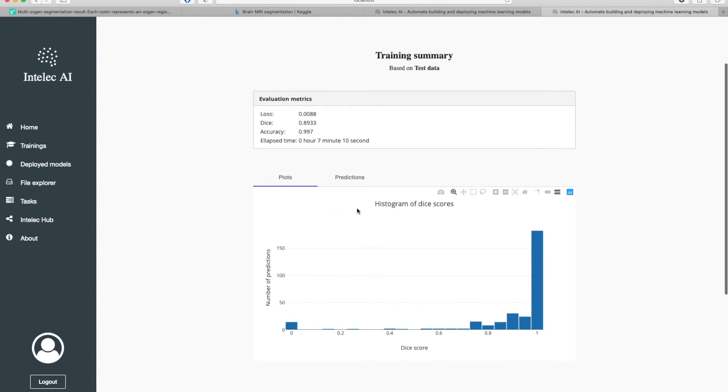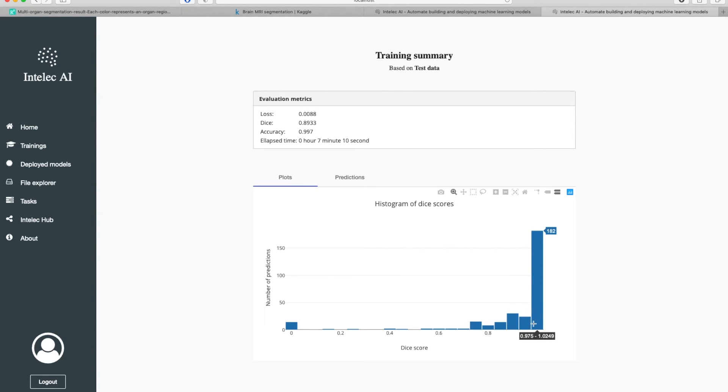This is the histogram of dice scores. We see that for most of the images, the dice score was either close to one or one.